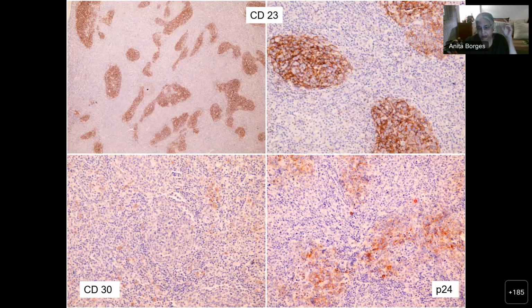So this guy had HIV-associated lymphadenopathy. You had many different kinds of follicles. Some were atretic, that means they had collapsed. Some were just like normal follicles. Others were so ill-defined, as you can see by the way the follicular dendritic cells are outlined.